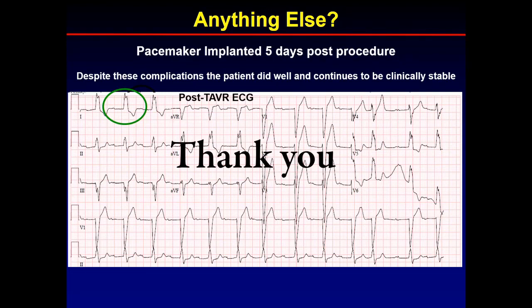I don't know, it depends on your equipment and whether you have a more advanced sequence that you could push into systole, but most often it's diastolic. So especially when using a balloon expandable device, you have to account for that, because those sizing charts are all based on systolic dimensions. If you're using a self-expandable device, it's less important, because those are more forgiving in terms of the degree of oversizing. For that reason, in that paper, we applied a corrective factor to account for those dynamic changes which you would miss. Then, of course, the pattern of calcification, you can get an idea on MRI, but I think it's not as accurate. So I would actually do a combination of a non-contrast enhanced ECG-gated CT plus the MRI.